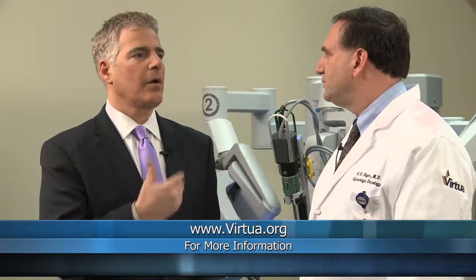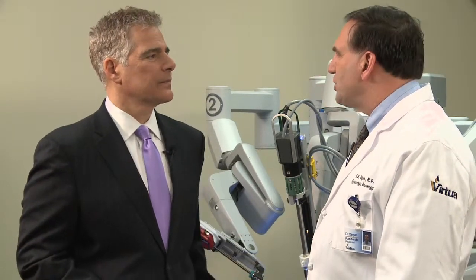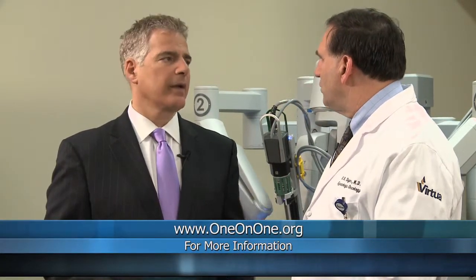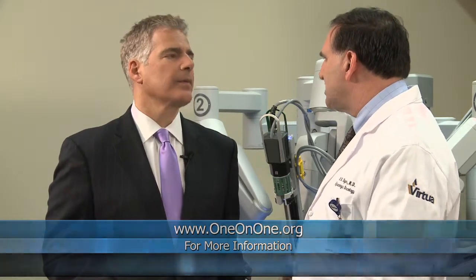Now, before you go over there and give us a demonstration, Doctor, which women are the best candidates? Well, because of the small incisions and the population, which is becoming larger, particularly endometrial cancer patients tend to be larger patients, this technology... No, that's endometriosis, someone with endometriosis? Well, endometrial cancer first. Okay. They tend to be larger patients, and this technology has helped them recover quicker, with smaller incisions, avoiding large, big incisions, making their return to life much more rapid.